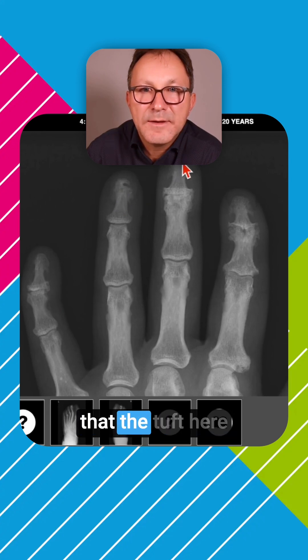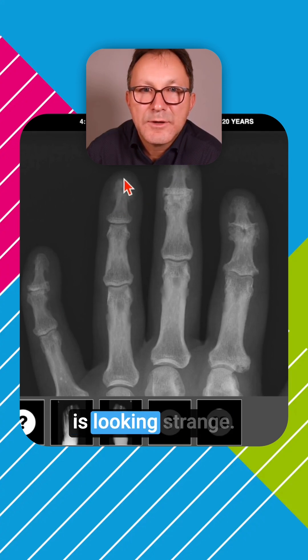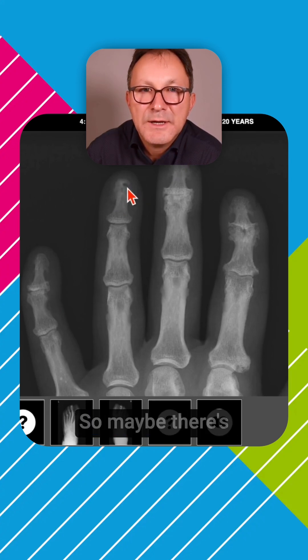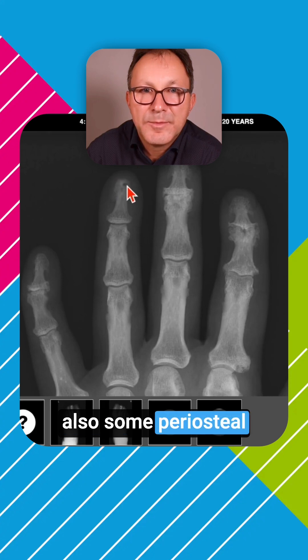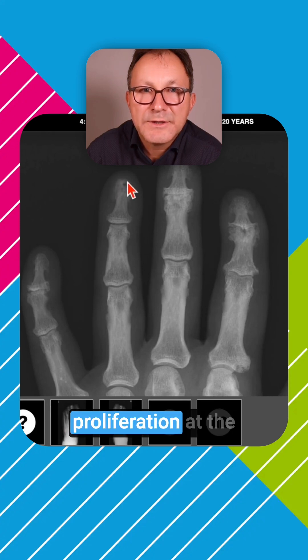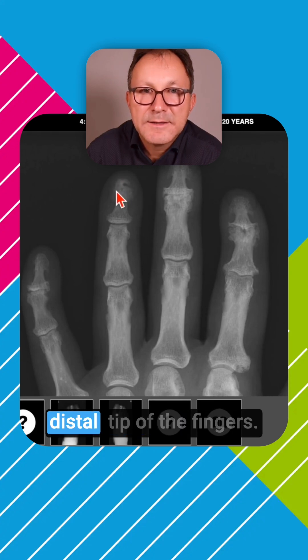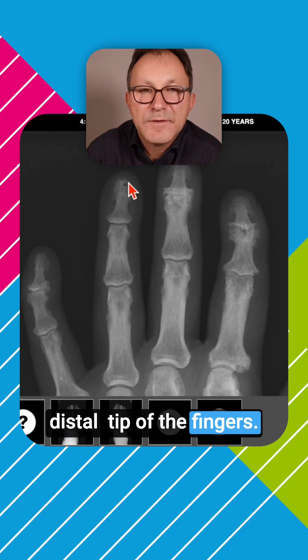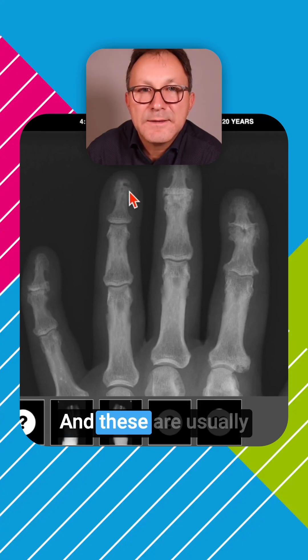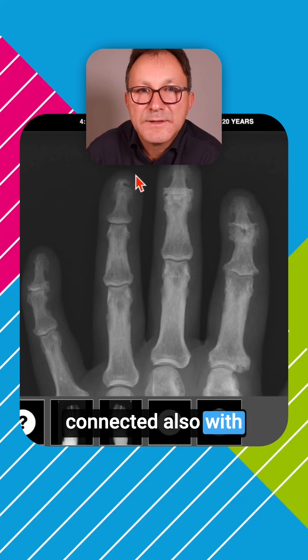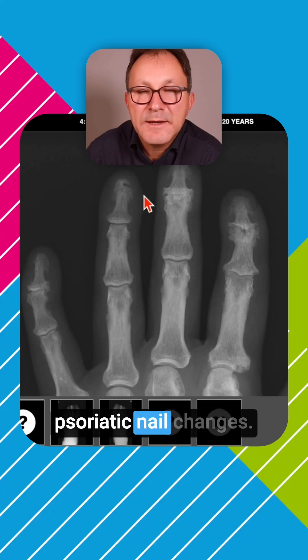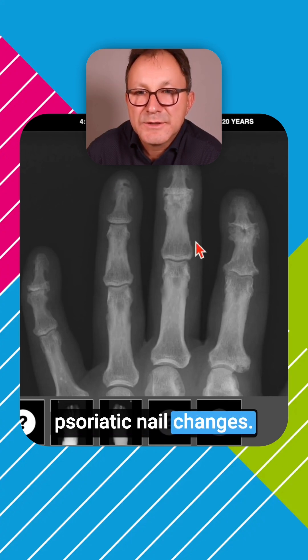The tuft here is looking strange, so there may also be some periosteal proliferation at the distal tip of the fingers. These findings are usually connected with psoriatic nail changes.